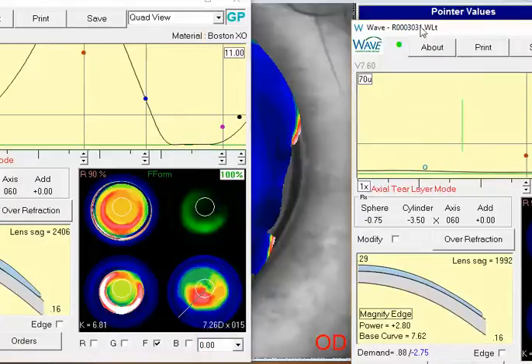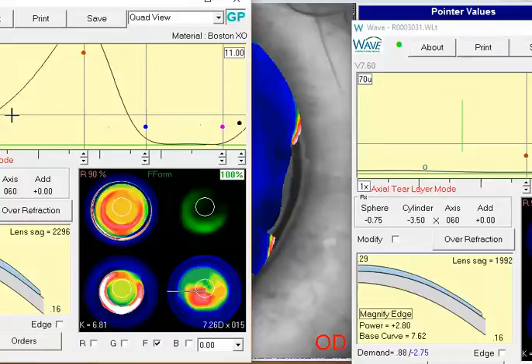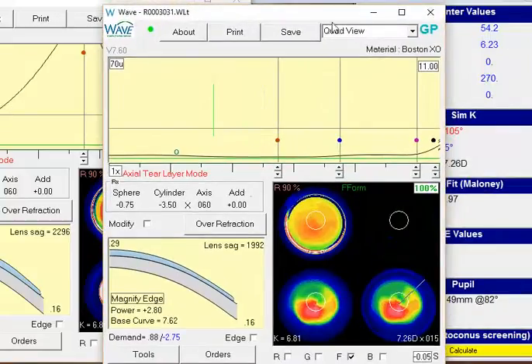If we look at your lens, although the lens overall looks nice, you'll tend to notice that you've got a pretty nice landing area here, but you've got a lot of ups and downs everywhere else. So I think this will help that lens line up a little better.